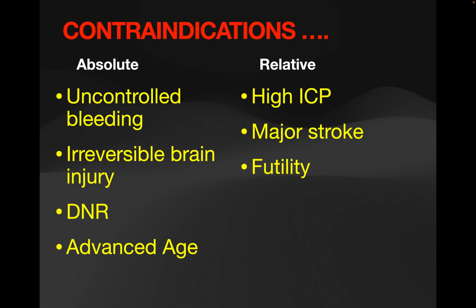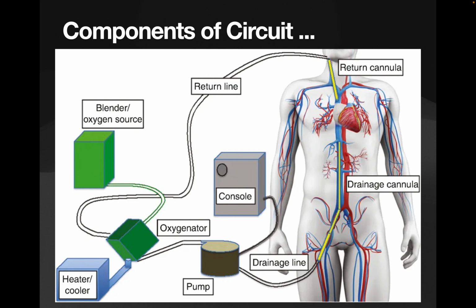Whereas relative contraindications are high intracranial pressure, major stroke, and the futility of the efforts if they have been discussed. So as I said, these are the components of the circuit.